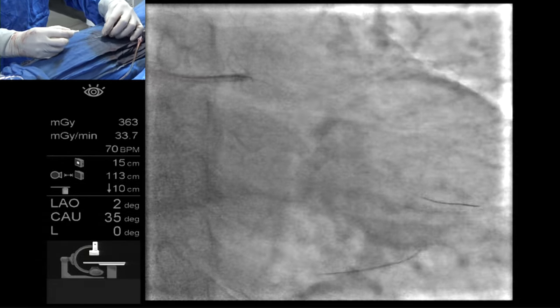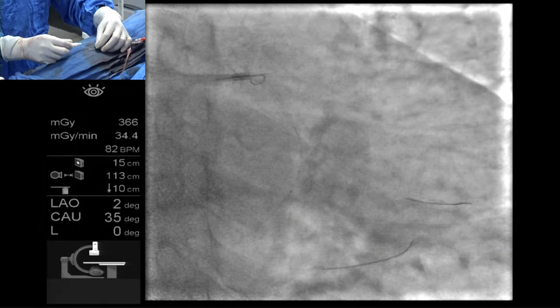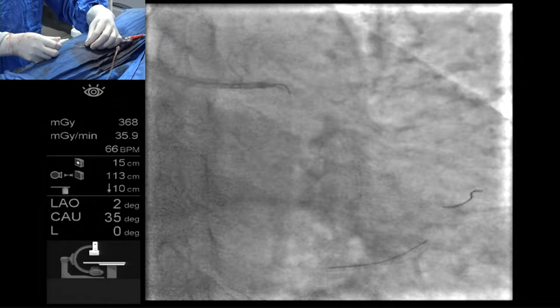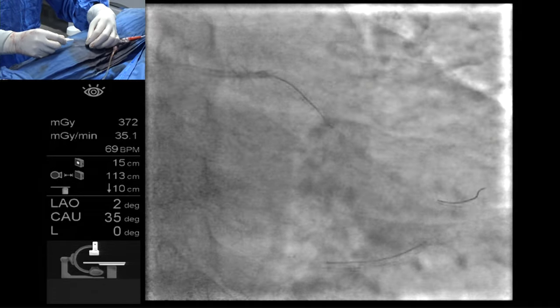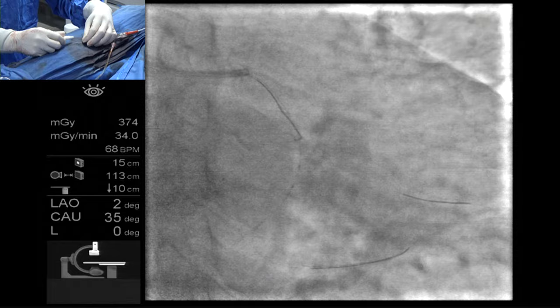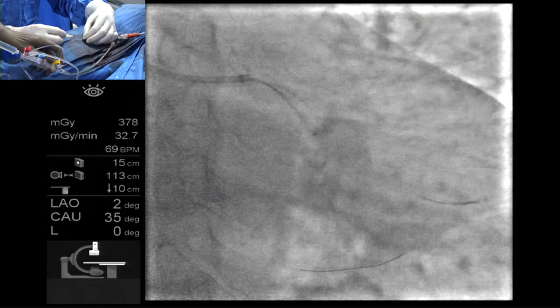So Tak, what is your incidence of never being able to cross into the stent? First kiss or obviously second? I mean, no cross at all. I think very rare, very rare. But I cannot say never. The first kissing balloon inflation is the most important. Right. Once after you get that, after that, then it's much easier.